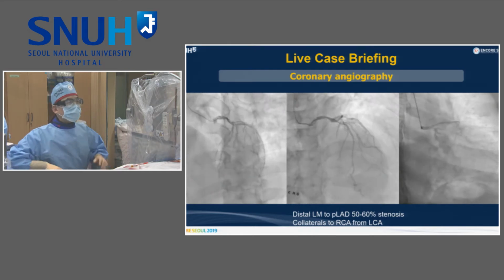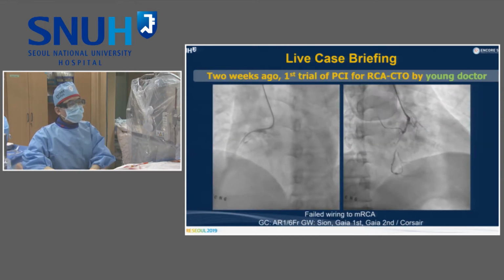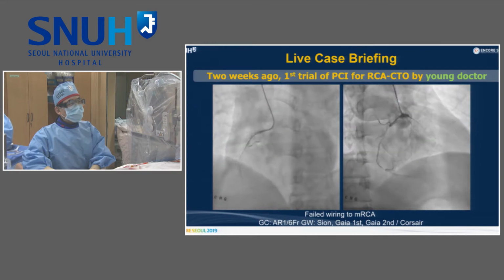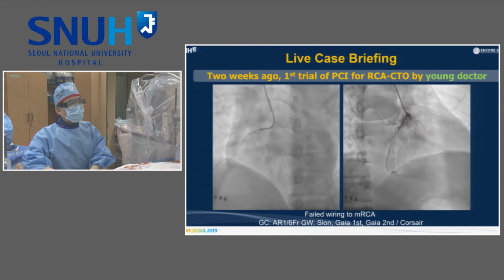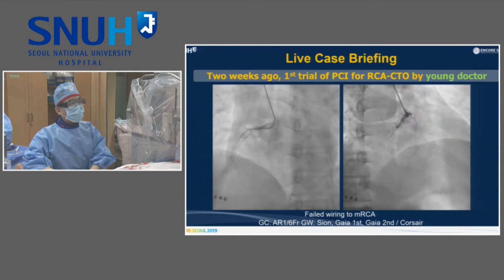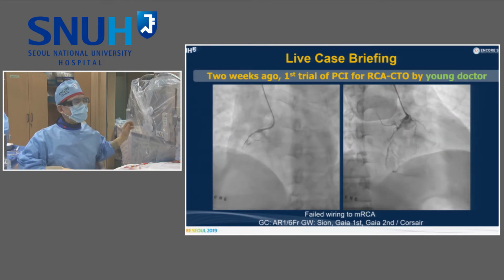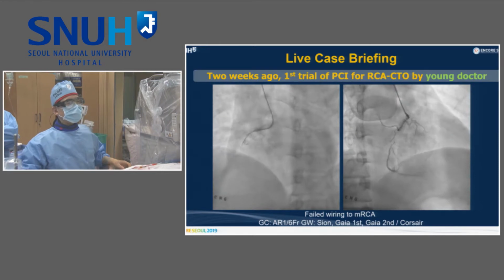Okay. If you remove Dr. Finkelstein's comment, you'd better have some evidence for objective ischemia. What I mean is a thallium scan or other evidence. It's okay. We are convinced. No, it was just educational, Kim. Okay. We want to see your strategy. What do you plan to do?